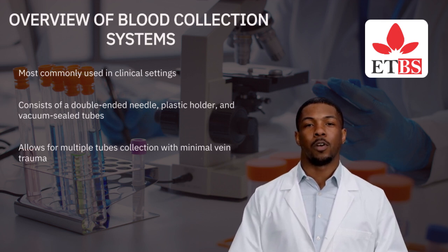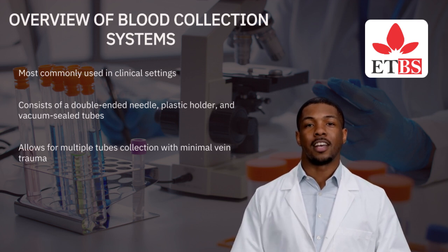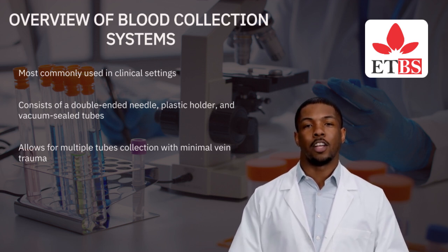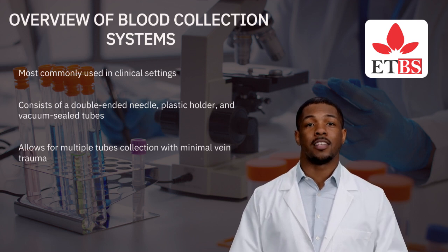4.1 Overview of Blood Collection Systems. There are three primary systems for collecting blood. 1. Evacuated tube system, ETS, most commonly used in clinical settings, consists of a double-ended needle, plastic holder, and vacuum-sealed tubes. Allows for multiple tubes collection with minimal vein trauma. Advantages: safe, quick, minimal exposure to blood. Disadvantages: requires strong veins, can collapse fragile veins.